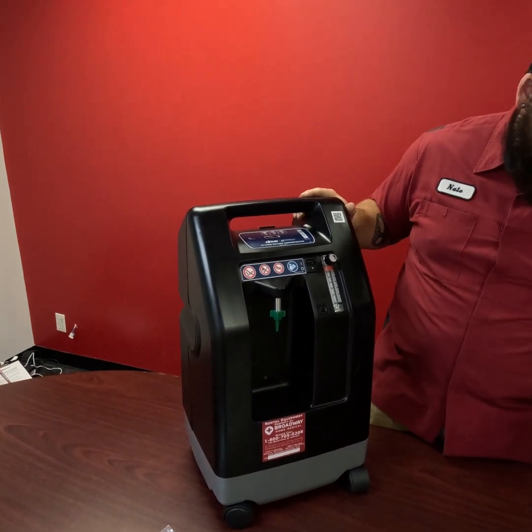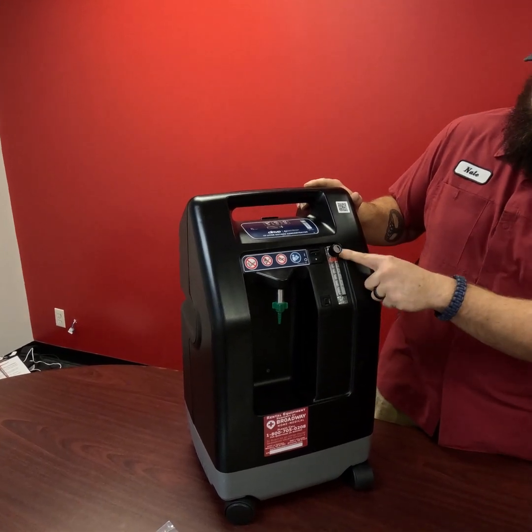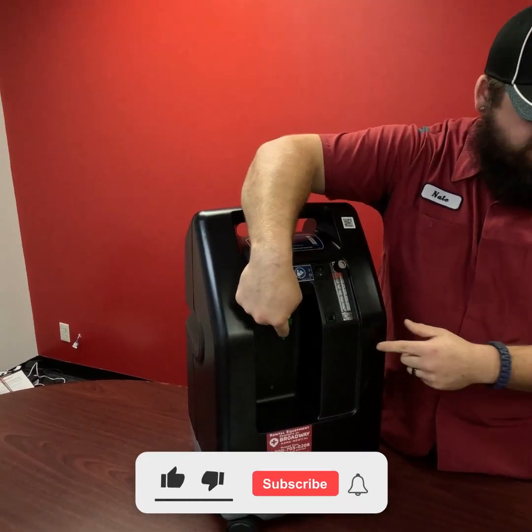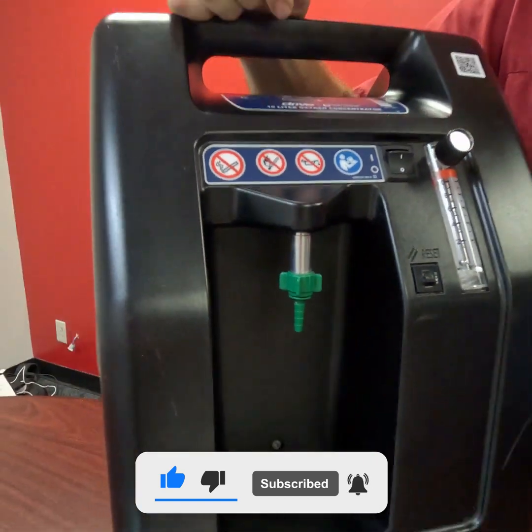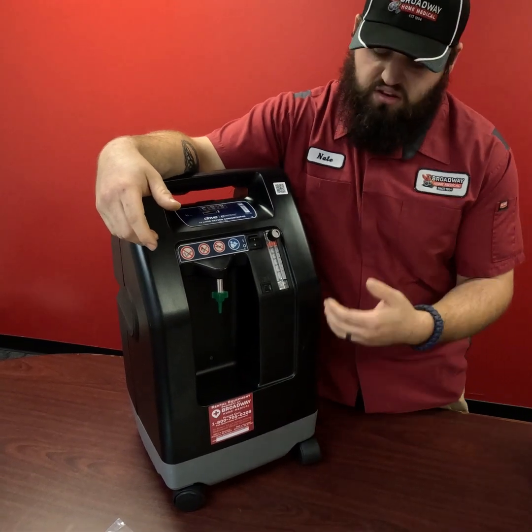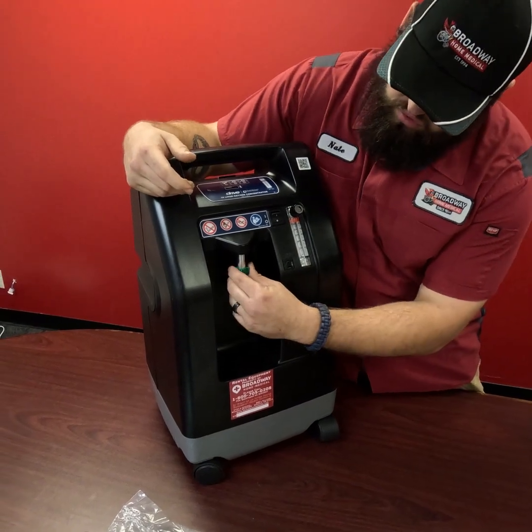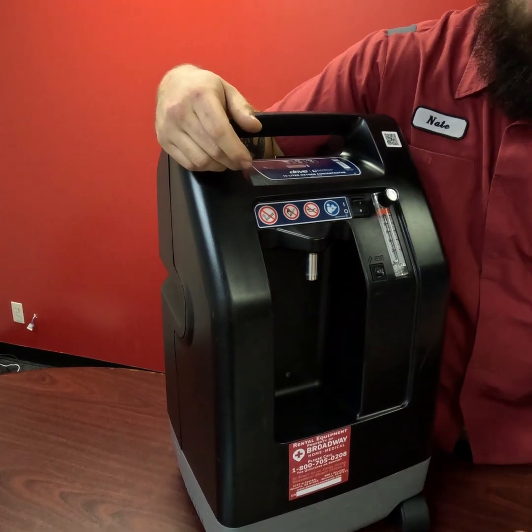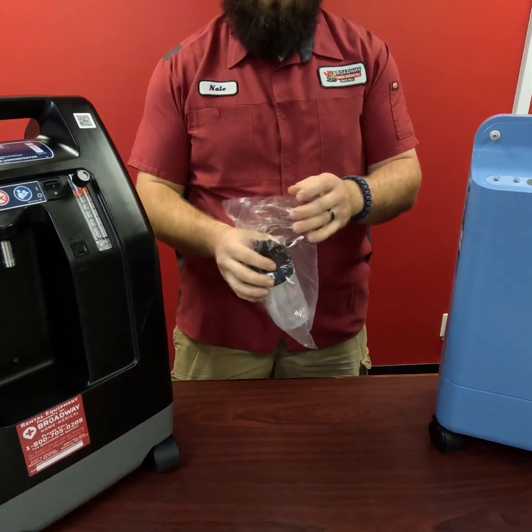And a lot like the Everflow here, we have some similar things. We have a flow meter, our power button, and a nipple to hook up hoses. Where these machines are a little bit different, this nipple here can be removed, and we can actually hook up what's called a humidifier jar. So we'll go ahead and remove this, what we would call a Christmas tree. That's what we like to call those. And we'll go ahead and set up this humidifier jar.